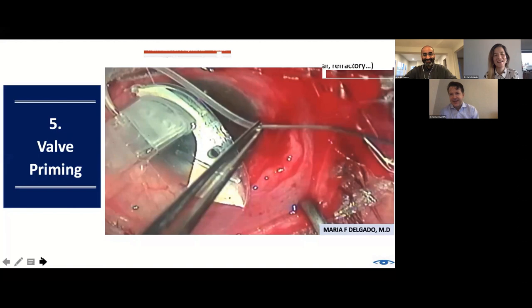If you ever take the Ahmed valve apart, it's probably not quite what you think. It's basically two pieces of almost a material, like not quite Saran Wrap, but a flexible little film. And they're just forming a little bit of pressure tension so that the fluid kind of only really pushes one way. So it's not something that can be blown apart, it's really a plastic flap made out of a flexible material. So I don't as much worry about too much pressure harming it, which I have heard is a concern, but I've never seen one where I felt like an overprime did damage.